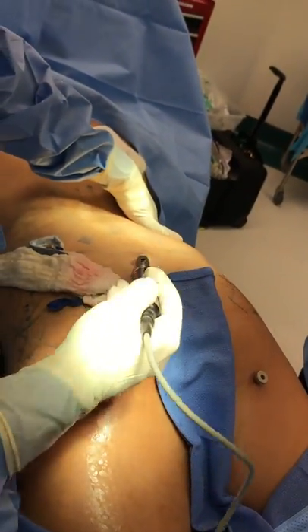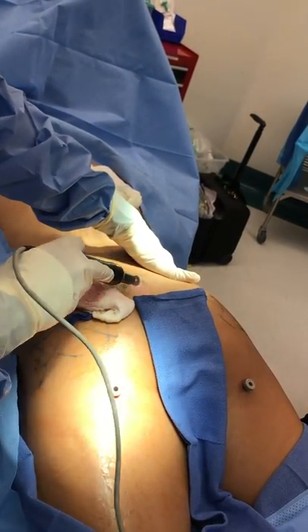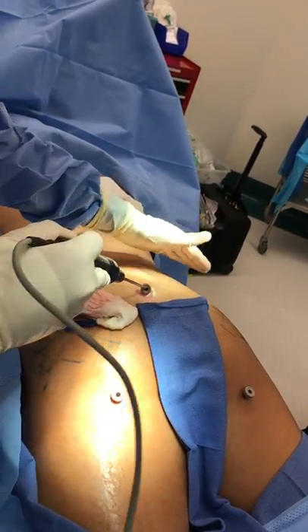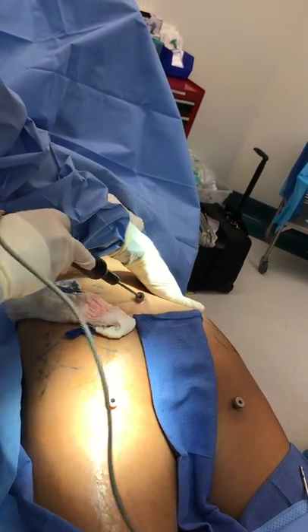So we're dissolving some of the fat right now, and then later we're going to use the cannula to remove a bunch of it, and then we're going to put it into her butt right around these areas to give more fullness all the way around.